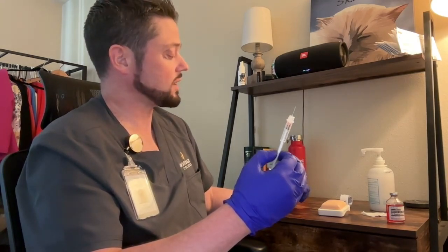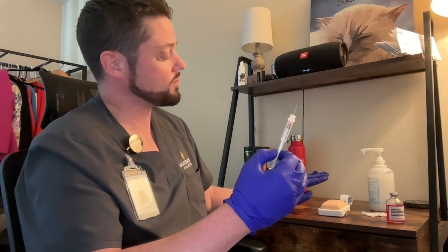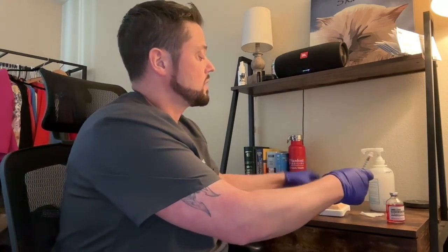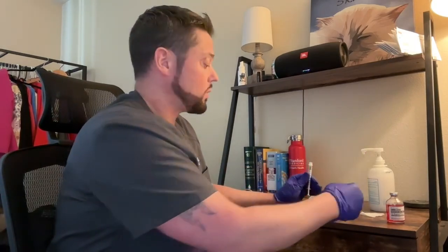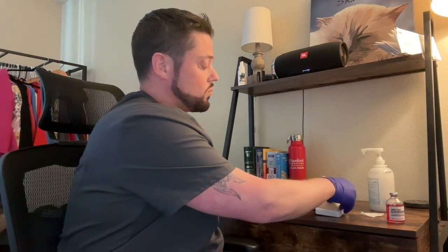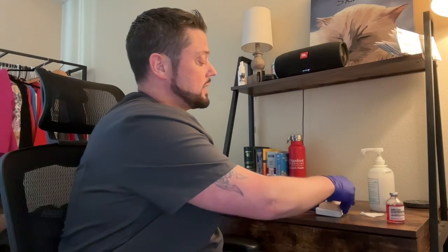And when we select our site, we want to do this by selecting 3 to 4 finger widths below the antecubital space and 1 hand width above the wrist. So we've selected our site. We're going to go ahead and clean the area. We're going to do this with an alcohol wipe. We want to scrub the site with a circular motion. We're going to scrub in a fashion by rubbing circular from the inside out. And we want to clean approximately 2 inches of space.